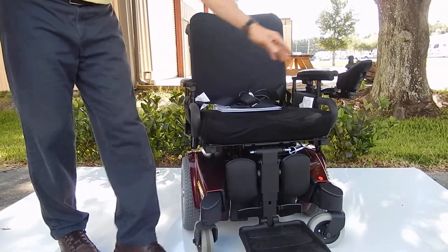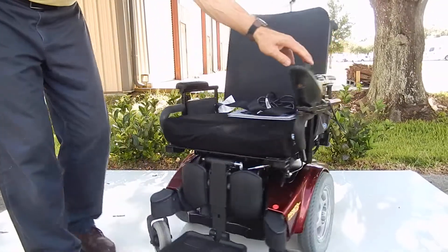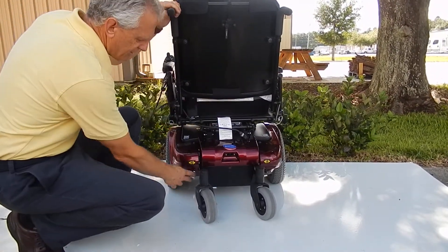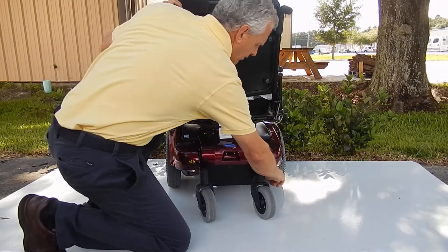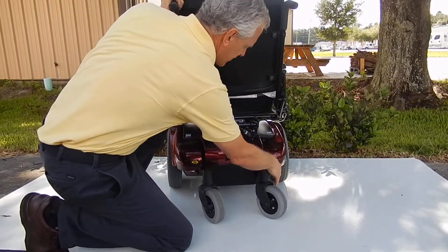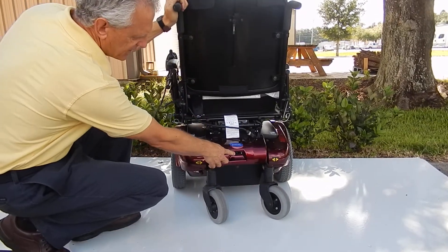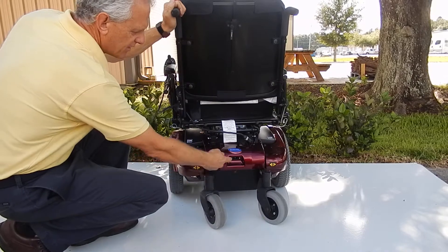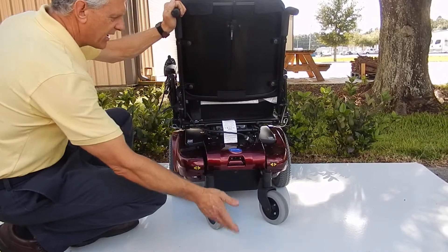Also, if you want to put this chair in neutral, the only thing you have to do is use the two levers right here — turn it outward and the chair becomes neutral. Put it back in gear so you can drive the chair. Your charger is built in. This is where you would plug the chair to charge it. You'd have a cord, which we will provide. Plug it in here, plug it into the wall.